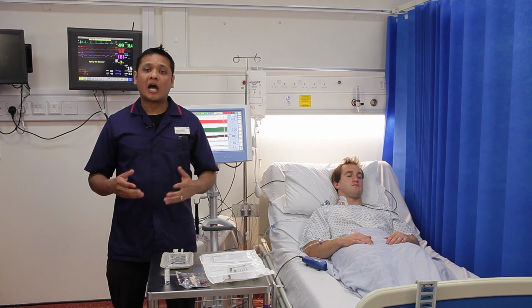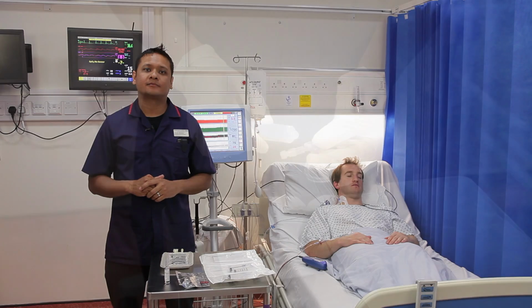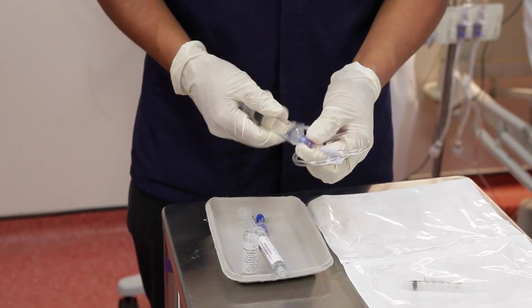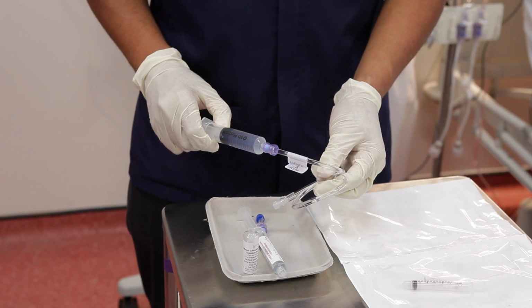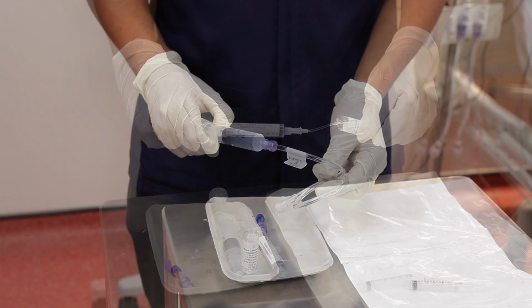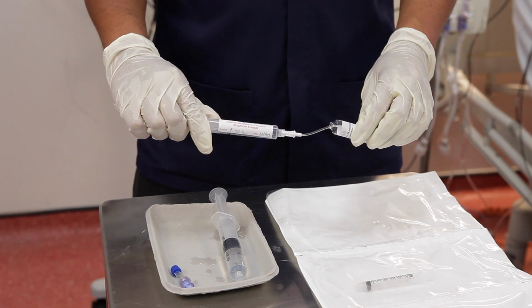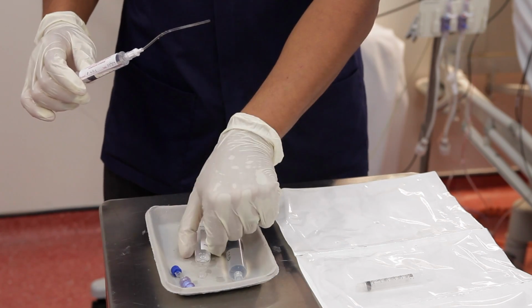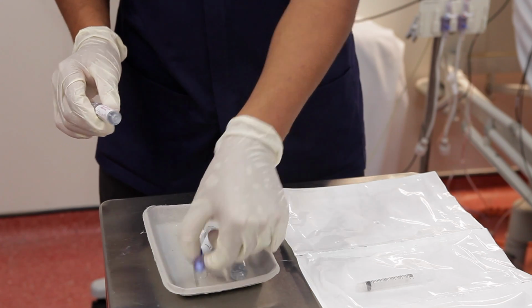In this section, I'll show you how to set up the venous side ready for calibration. Prime the park and ride tube with 0.9% sodium chloride and connect to either the CVP line or peripheral line. Next, take your lithium chloride ampule and draw up the full amount using the 10 ml syringe and quill. Connect the needle-free valve and label the syringe.